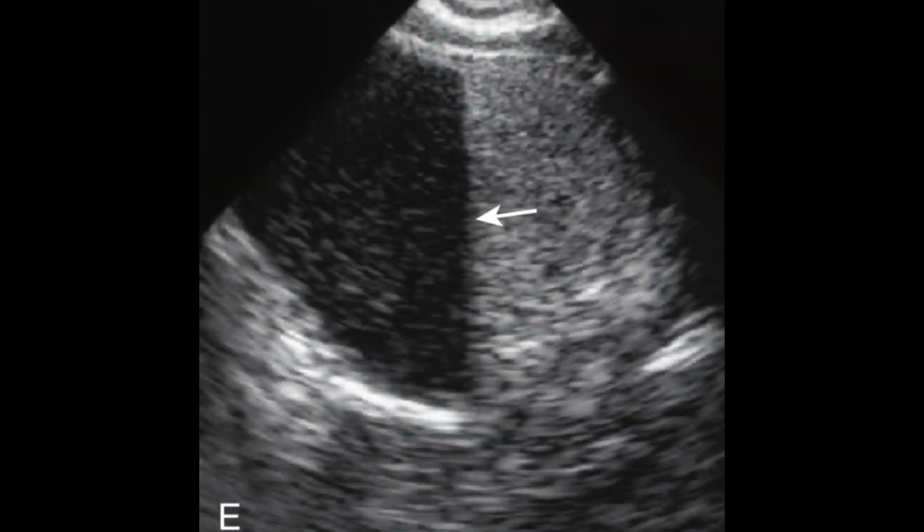In some cases, sometimes you will see some echogenic patterns which appear as a supernatant, but in this case it is deposited downward and forming a fat fluid level, and this is a dermoid lesion.